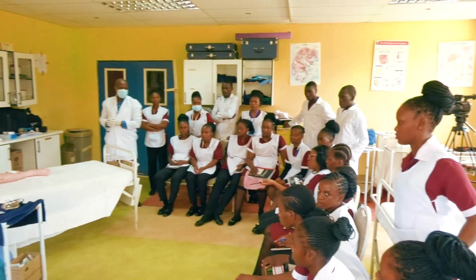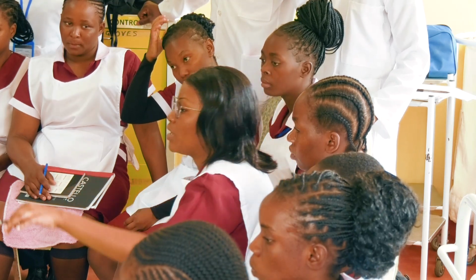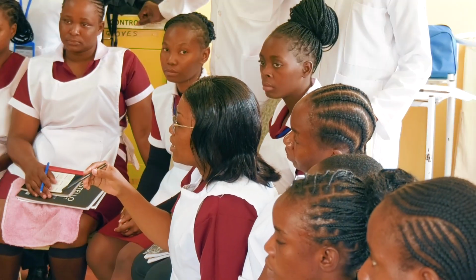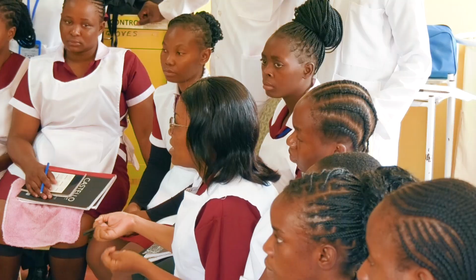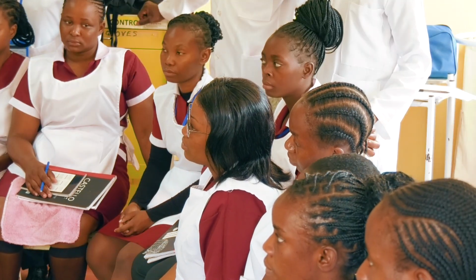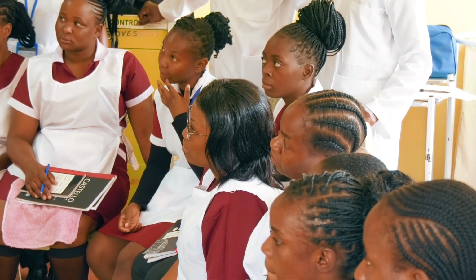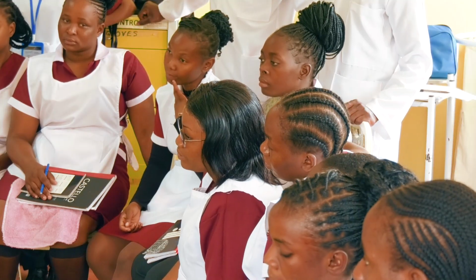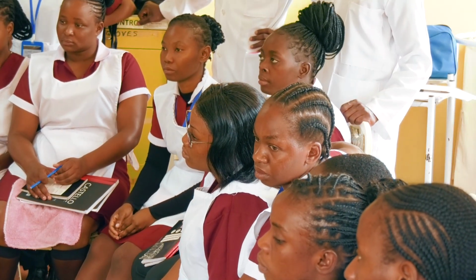That solution, do they receive vaccines or not? Okay, and ask about that solution, the one that you're supposed to put the used forceps in. Here, especially, you're not putting anything, since there will be no cleaning and no use of those forceps and removing of them. For this one, I'm not preparing you for an OSCE exam. I'm preparing you for practice. And hence, what you learn from here, that's what you are going to do when you go to the clinic, when you go to the hospital.